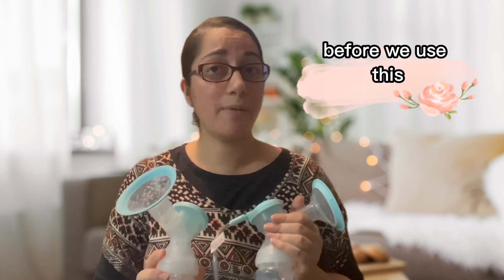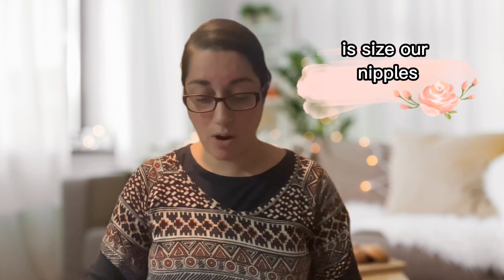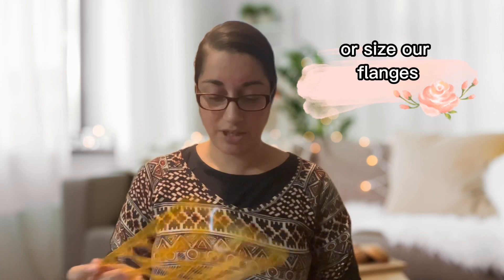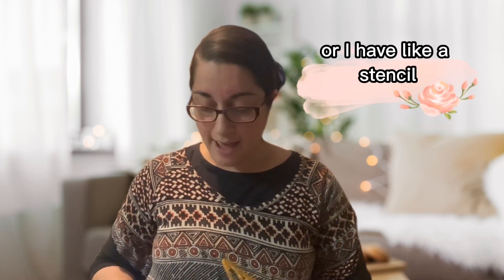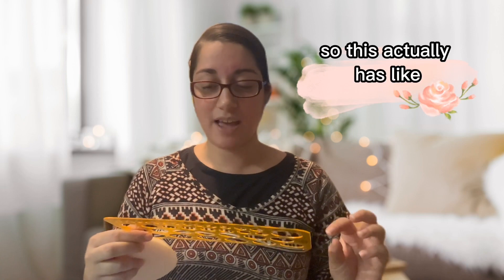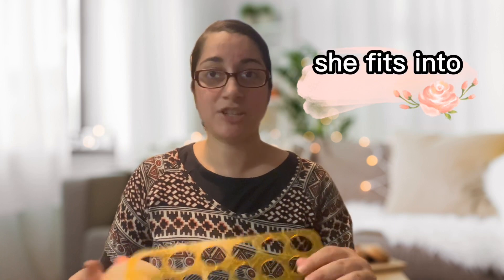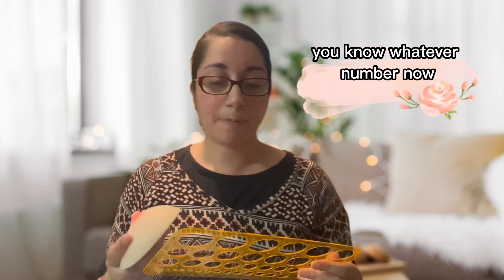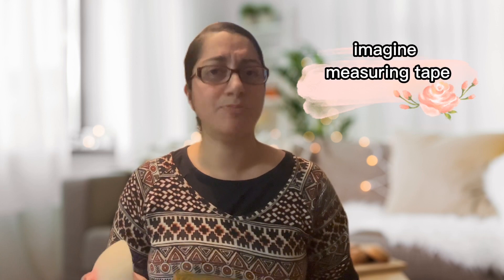Before we use the pump, one of the first things we should do is size our nipples or size our flanges. You can kind of do it by eye, or I have a geometry stencil that has different numbers. I use this for a lot of my clients so you can see which size she fits into. Or you can even use a simple ruler or measuring tape.